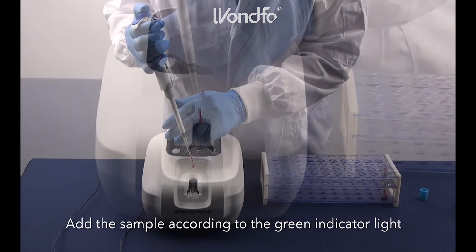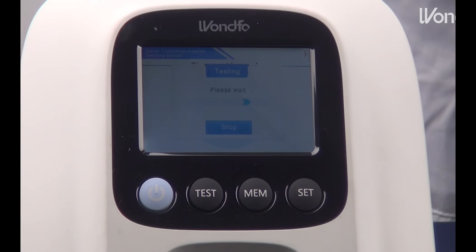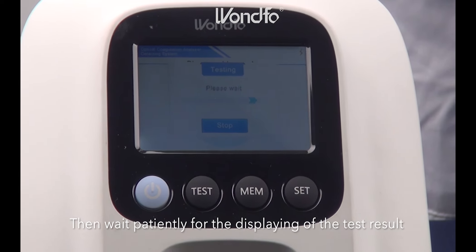Add the sample according to the green indicator light. And now we can wait patiently for the displaying of the test result.